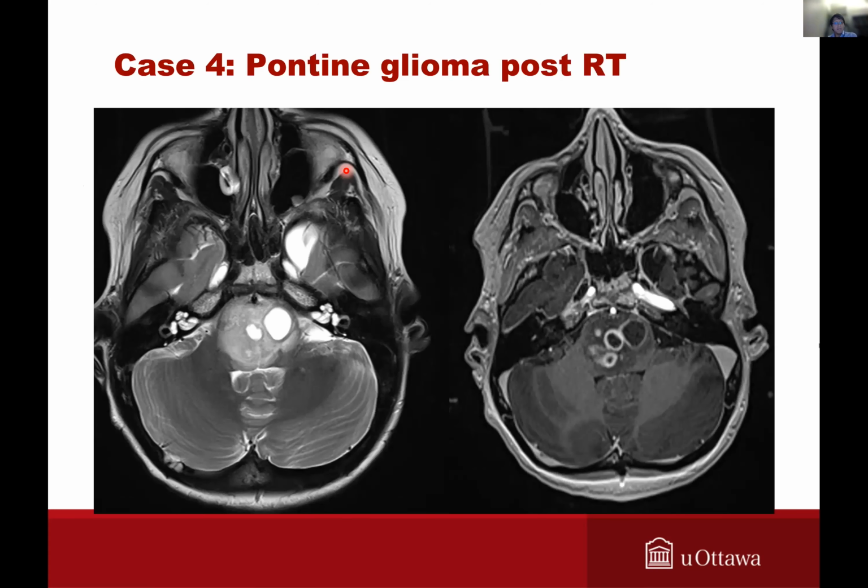This is a different patient. This is a patient that presented with a pontine glioma, and the patient had radiotherapy, with some areas of enhancement.